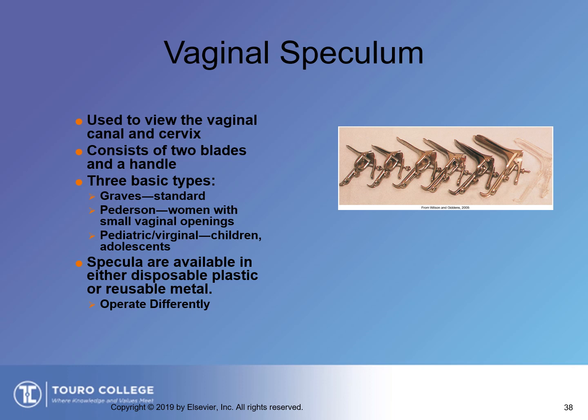The vaginal speculum. I don't do vaginal exams in my setting, but lots of urgent cares do, lots of emergency departments do, and in women's health, you do them all the time. There is a whole bunch of different ones. Two blades and a handle. I think you're going to find the most commonly used are the disposable ones.